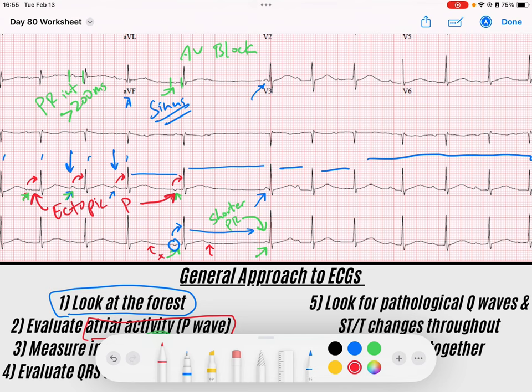That deflection is a premature atrial contraction. It's a P wave that comes early — a PAC that occurs so early that it's non-conducted, meaning the AV node was still refractory when it arrived. This is a blocked premature atrial contraction, and because of that we get a compensatory pause.